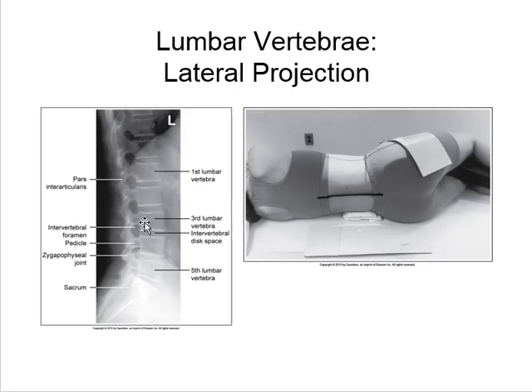Trina probably went through some pathologies as well, some bamboo spines, some spondylolisthesis, ankylosing spondylitis. But what you'll see is an incidental finding in a lot of cases. The patient got in a car wreck and you shoot an AP and a lateral L-spine on them because they have back pain.